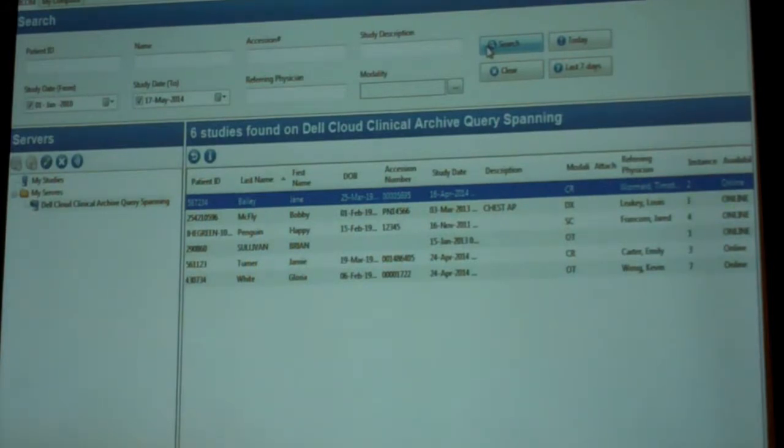So that's an example where you have a PACS type client or workstation type client. You may have a local system, and you want to know everything for that patient that's local, but you also want to check against the regional HIE, and you don't have a connected LAN or VPN to them, so you want to go over HTTPS, use the context that you know locally, collect that as a complete patient longitudinal record and present it, even though that's not all in one system, not all in one database. And that's the power that these REST-based APIs allow you to traverse these things, and not just patient record data. As we heard about HL7 FHIR, it can also be problem lists.